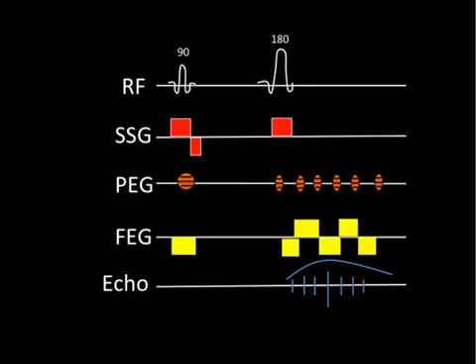Now, compared to a regular gradient, if you're doing an echoplanar that's a gradient, the sequence is even more vulnerable to magnetic susceptibility. And that gives you better tissue contrast and is faster. Now, all this gradient switching on and off, this is the noisy one. So I'm pretty sure that in my book I call echo planar imaging the noisy one. So that's the thing to remember. That's the one that can damage your ears and stuff like that, is this echo planar.